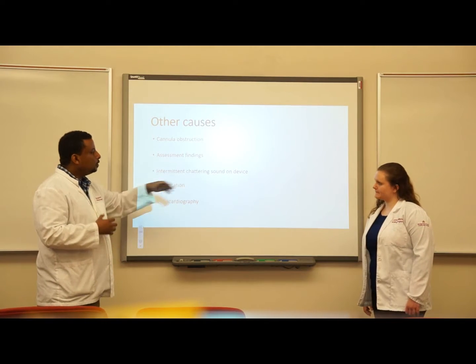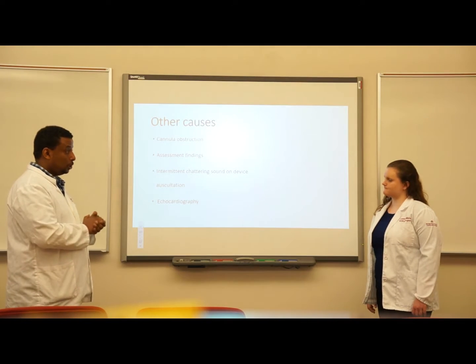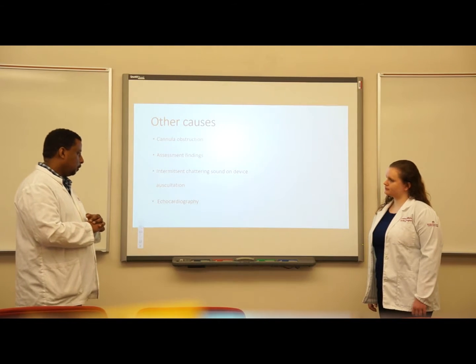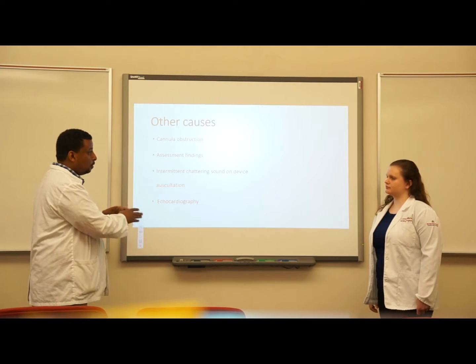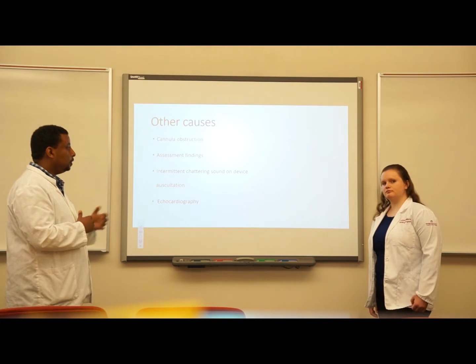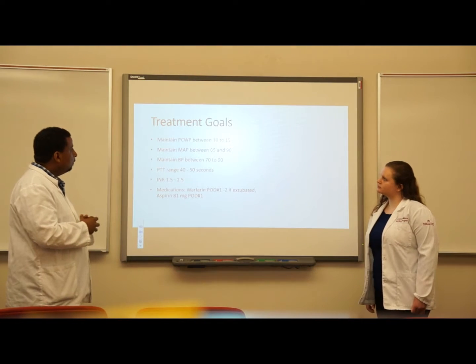If you hear this chattering sound, that is an indication that there is an obstruction in the cannula. It should be confirmed by echocardiography. Our job as nurses is to make sure there is no such sound. If there is, we communicate our finding to the physician, and he or she will order the test to confirm.